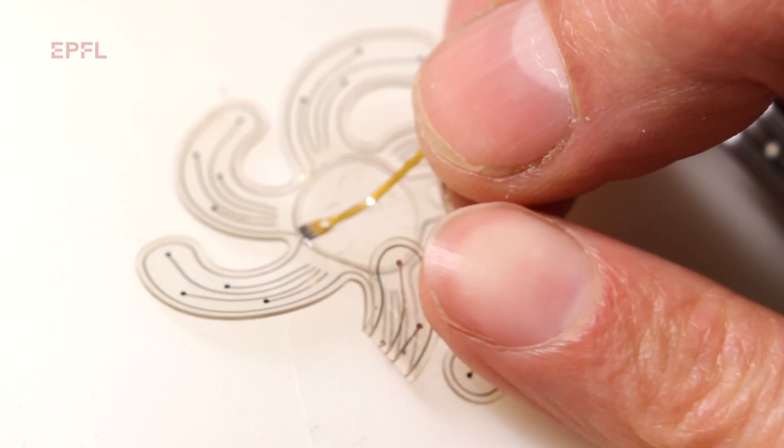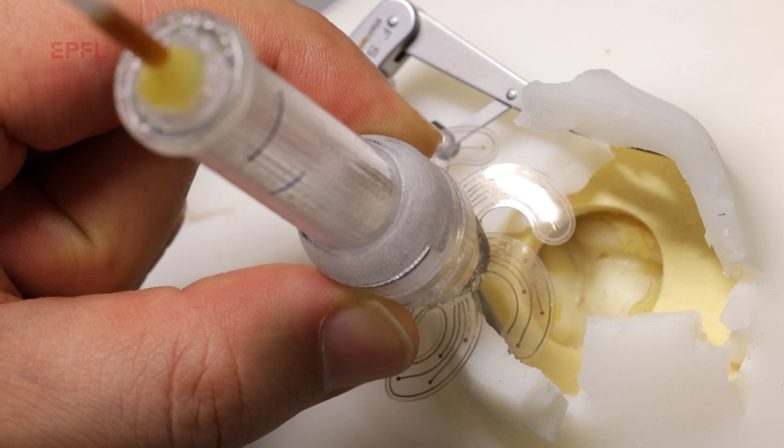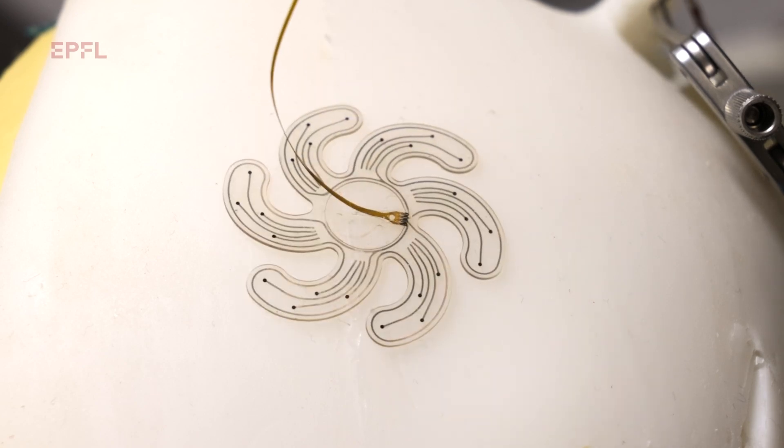We think this is a technology that could be deployed widely at the clinic because of its minimally invasive nature. What we hope to achieve now is to scale the technology to fit humans and increase the number of electrodes so that we can have richer information from the brain.